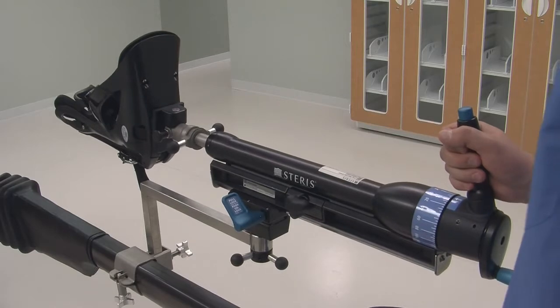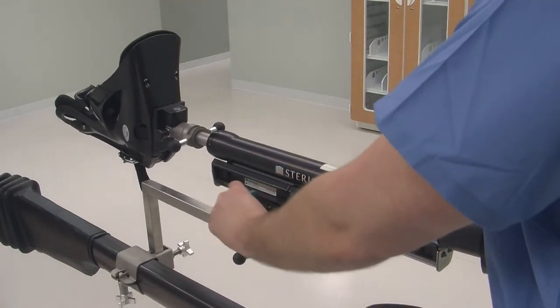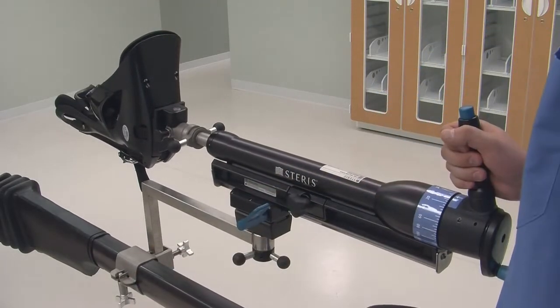When attached to the table, the fine and gross traction units will help facilitate proper patient traction on the OT1000 series tables.